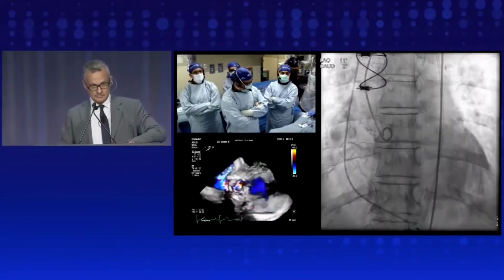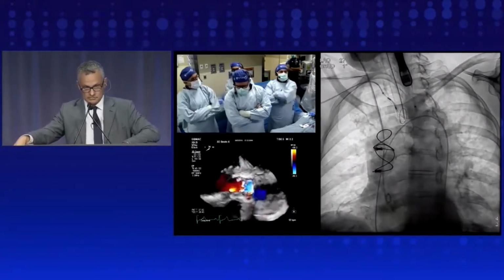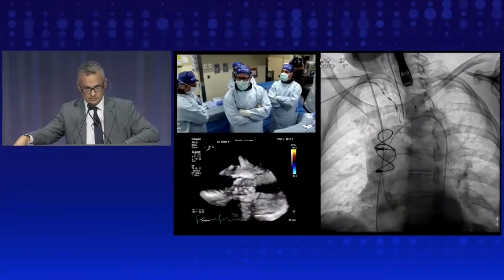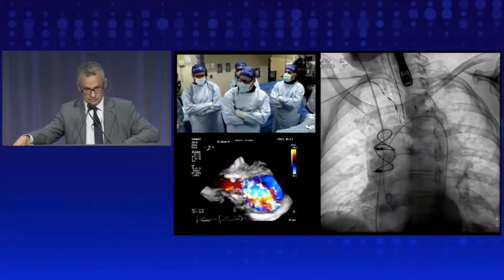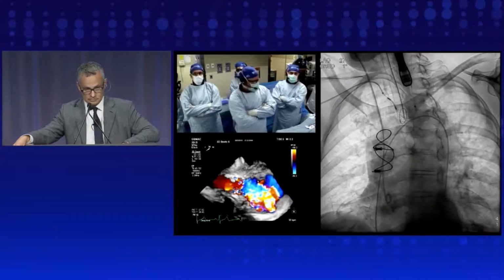Yeah. So I'll ask Jamie to comment. He's been very proactive in using these devices. So Jamie, your comments about use of Sentinel? Yeah, we have adopted it lab-wide on our transcatheter aortic and mitral cases. So much MitraClip, but any valve replacement case.